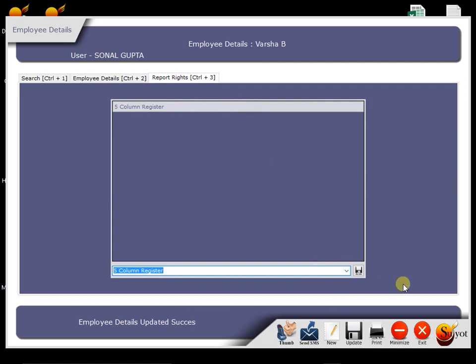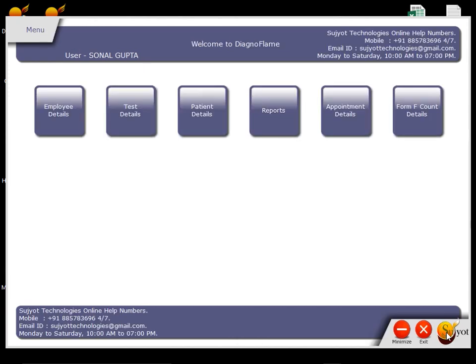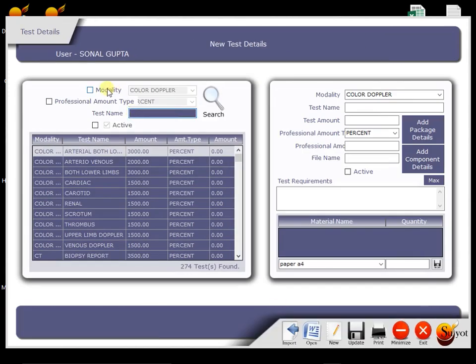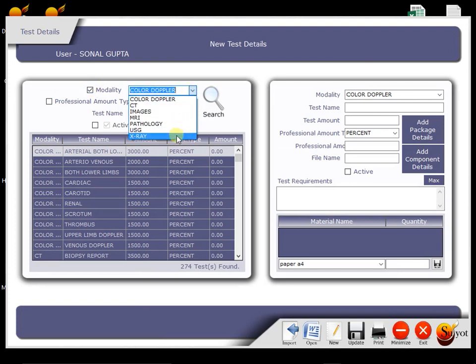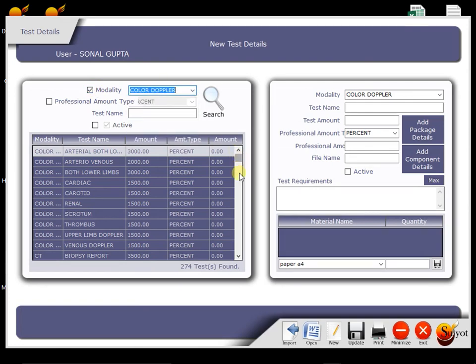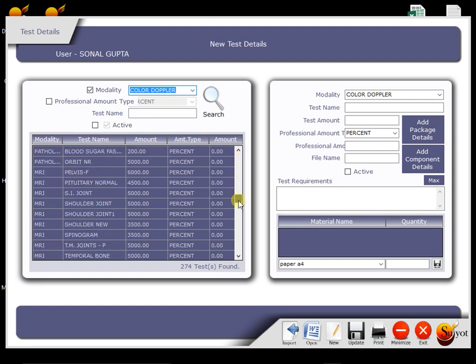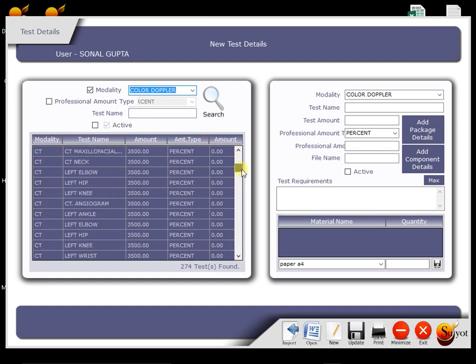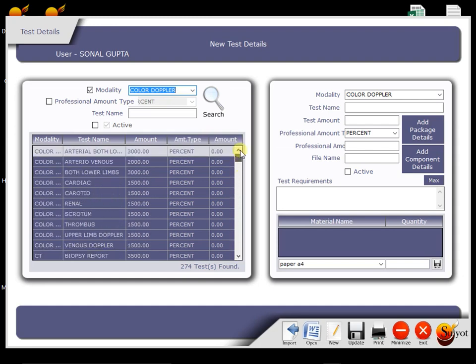That is all about Employee Details. Now we move to the next menu, that is Test Details. Now these are all the modalities which we may have in our clinic and these are all the report templates which come under those modalities which we provide with the software.